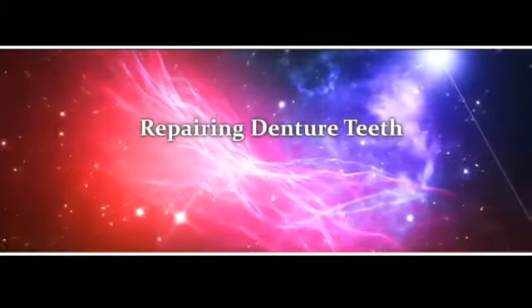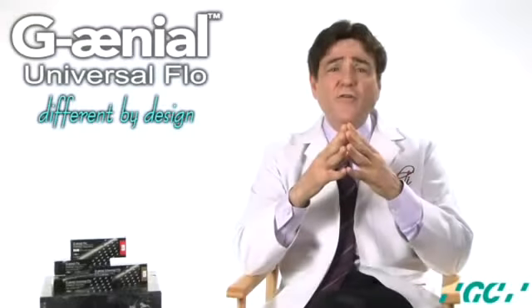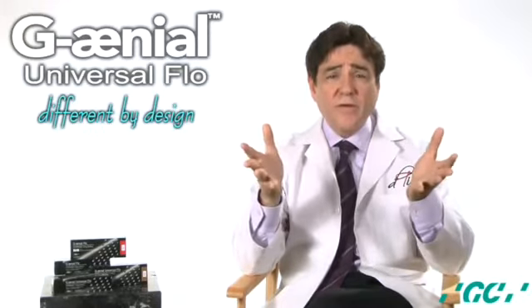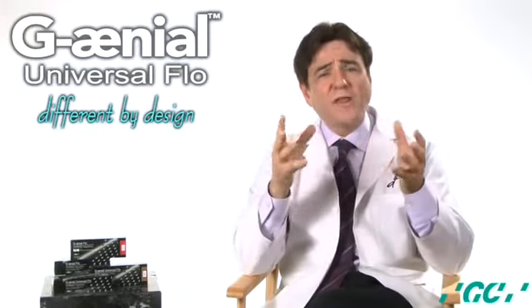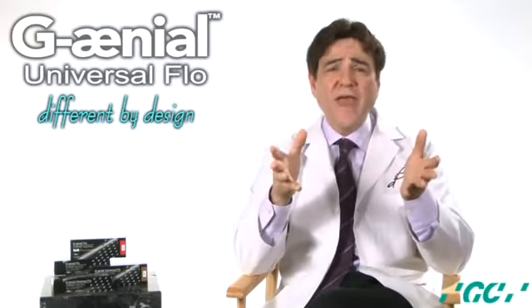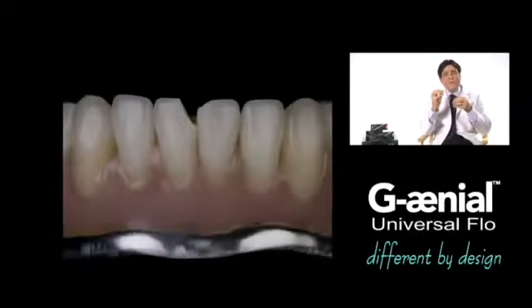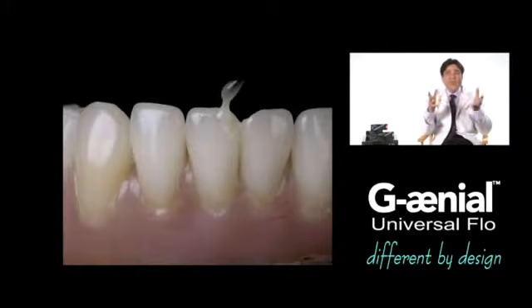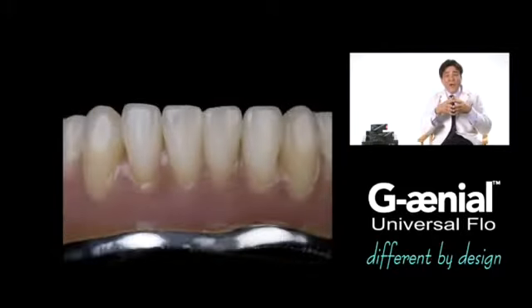Repairing denture teeth. Generally, fractures to denture teeth occur as emergency situations and require replacement. Replacement can be achieved with relative ease in the laboratory with an adequate inventory of denture teeth. However, with a proper surface treatment, these fractures can be repaired with next-generation flowable composite resins such as G-aenial Universal Flo at chairside.